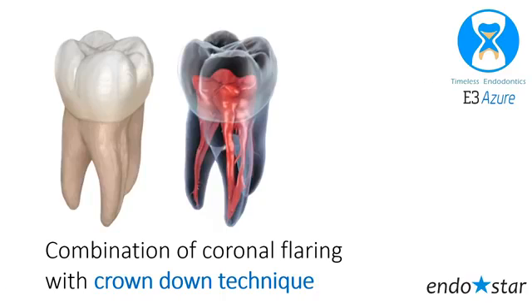My technique is hybridizing 2 points: coronal flaring and crown down technique at the same time. So what I will get from crown down and coronal flaring at the same time.